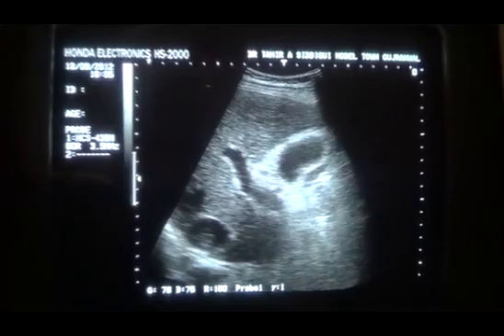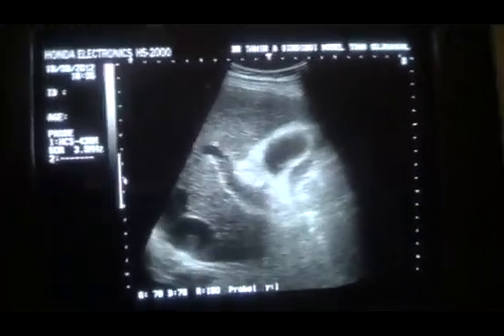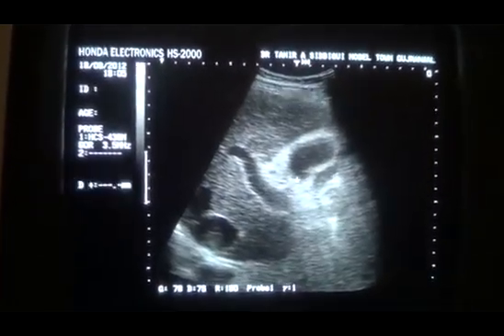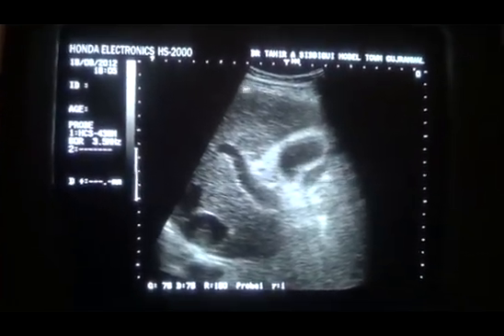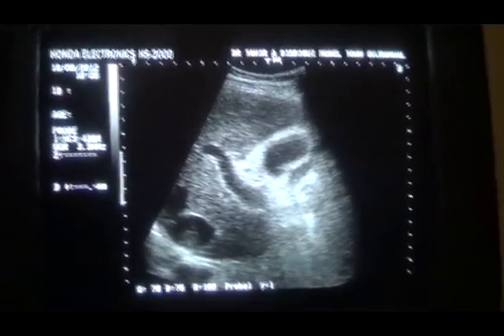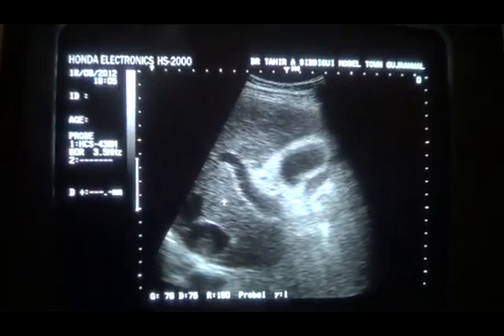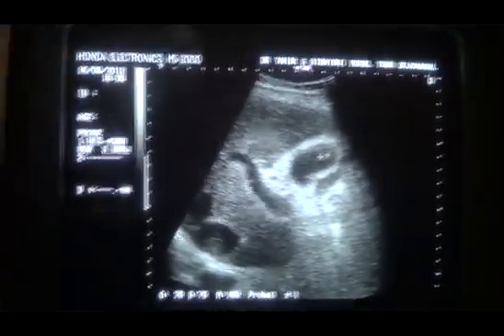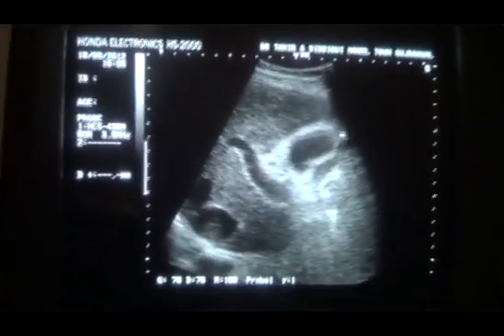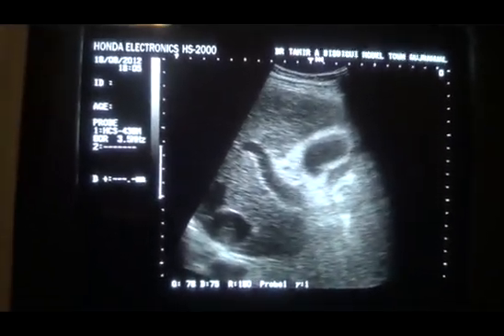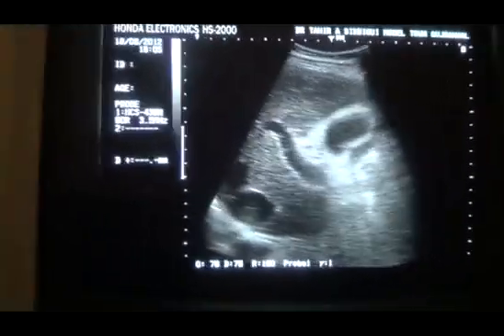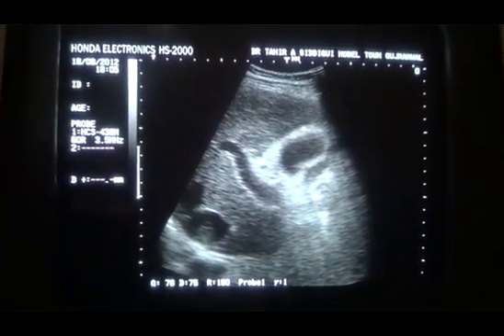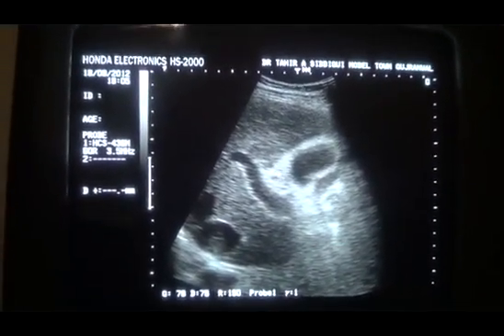Here I am showing you an image of a cirrhotic liver, in which this is the outer surface. This is the raised echogenicity of the liver and the coarse texture is also in front of you. This is the portal vein. This is the gallbladder, and the walls of the gallbladder always appear thick in a cirrhotic liver in most cases. This thickness of the wall is because of the adjacent cirrhotic liver.